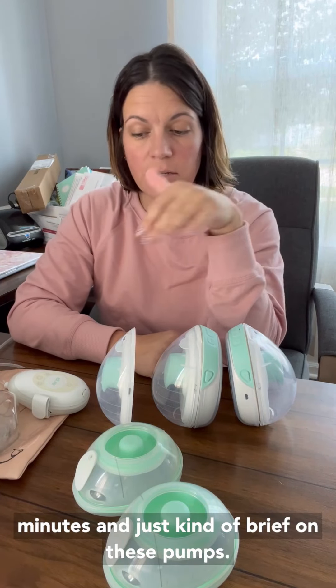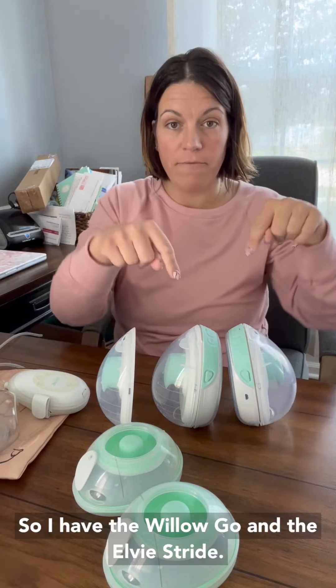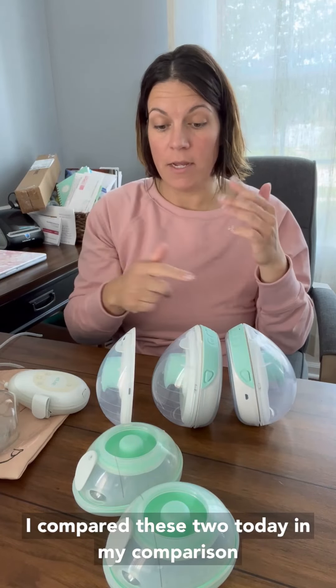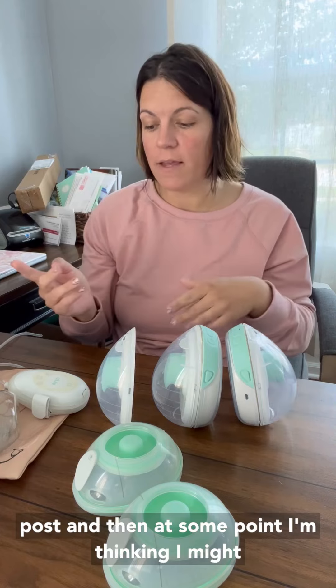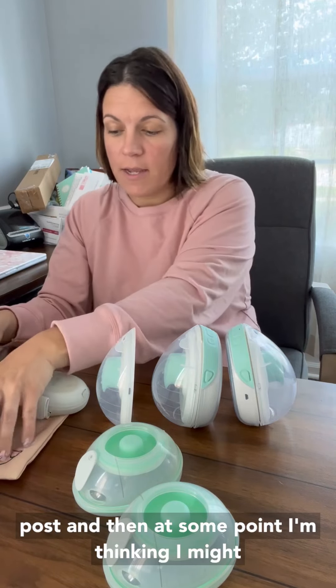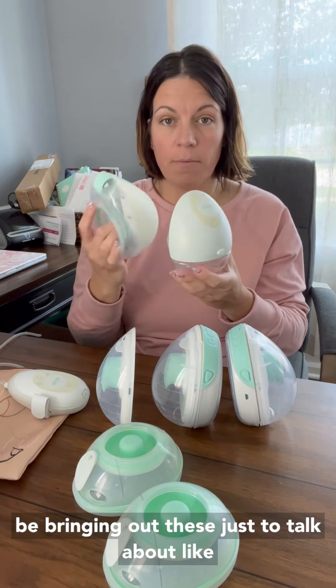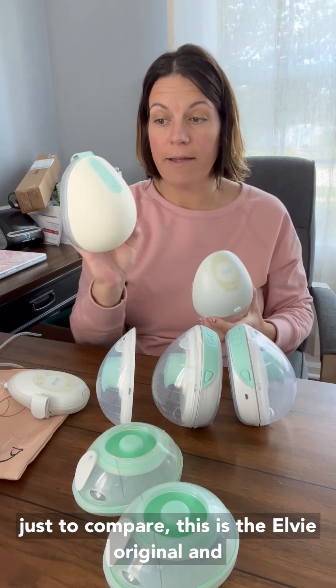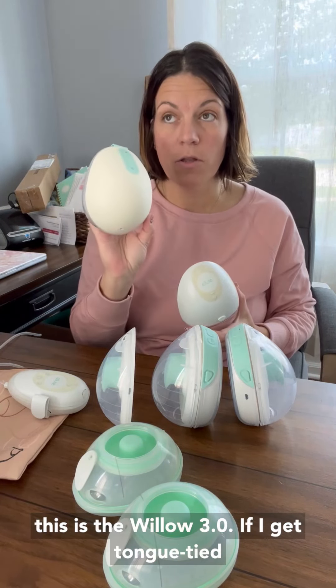I'm just going to take a couple of minutes and brief on these pumps. I have the Willow Go and the LV Stride. I compared these two today in my comparison post. And at some point I'm thinking I might bring out these just to compare. This is the LV Original and this is the Willow 3.0.